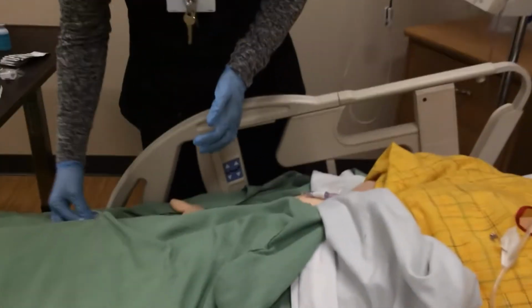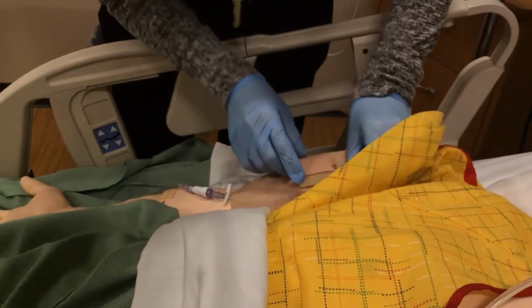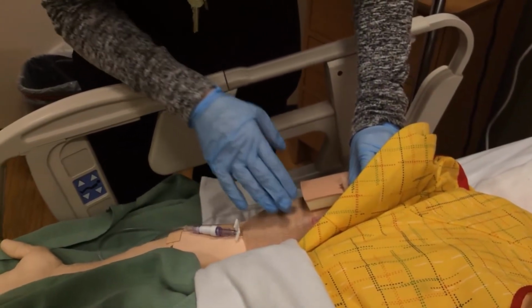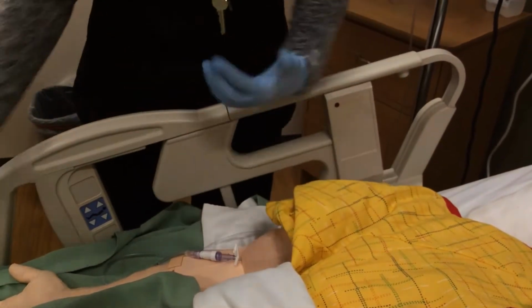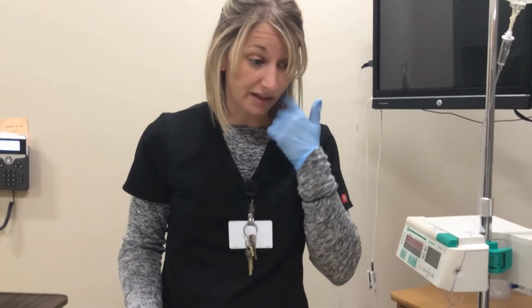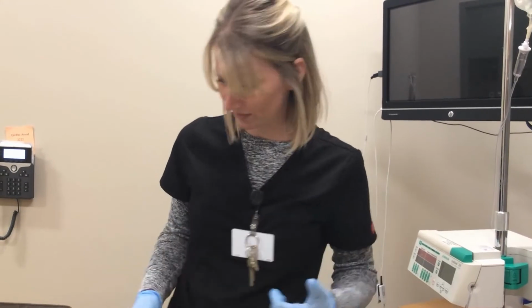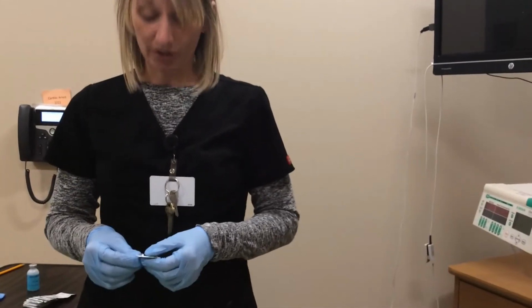The first thing that you always want to do when working with IV is check that site, make sure it's patent, make sure there's no swelling, no redness, no kind of drainage around it or anything like that. Because we want to make sure that the medication we're going to give goes in the right place. So we want to make sure that he gets the effects from it. Because if it's not being given IV like it should be, and it's going into surrounding tissue, he's not going to get the pain relief that he's going to. And certain medications can do damage to the tissue as well.